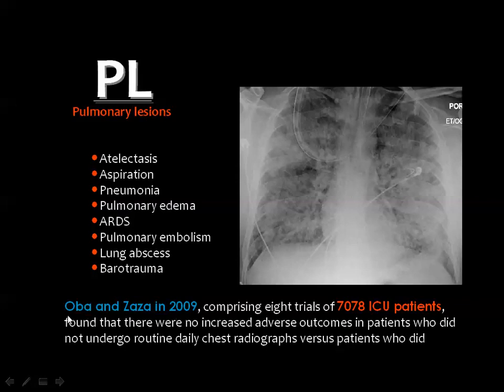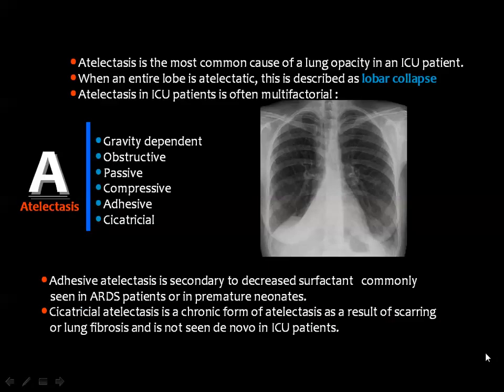Oba and Zaza in 2009 found that there were no increased adverse outcomes in patients who did not undergo routine daily chest radiographs versus patients who did these radiographs. But actually, as I have mentioned before, there are some real indications to do a chest radiograph, let's say in a regular way, to check for some of the devices and see the complications of insertion of the tubes.